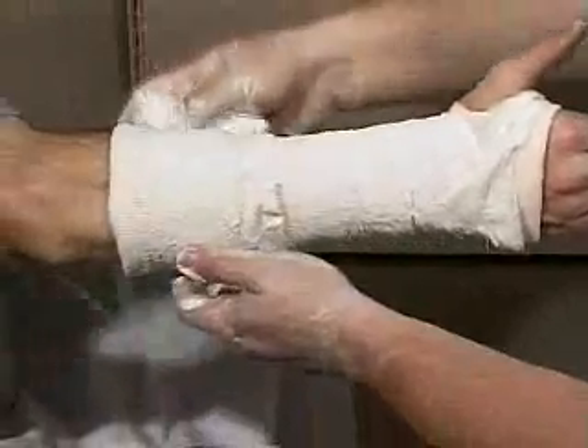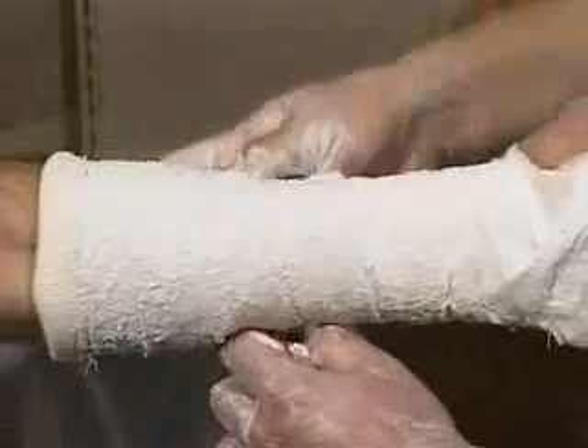Once the elbow is reached, return distally. When needed, tuck and fold away from the plaster roll the excess material along an edge. Finish off the roll and smooth the layers to consolidate.